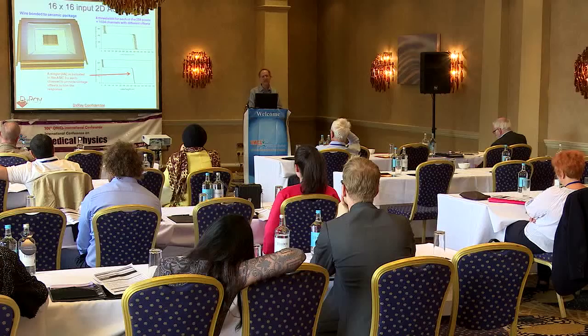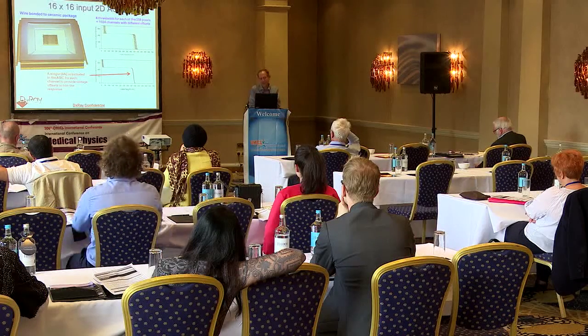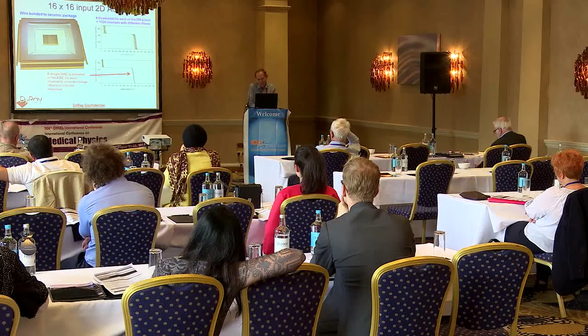And here you can see a picture of the full ASIC, which has 16 by 16 inputs or channels. And this ASIC was first tested by wire bonding it into a ceramic package. It also becomes impossible to calibrate these systems unless there's an automated method to do this. Now, each channel will have a slightly different offset and a slightly different gain. And the only way to compensate for that would be to adjust the offset at a particular different energy.